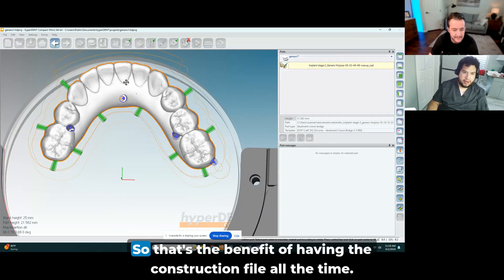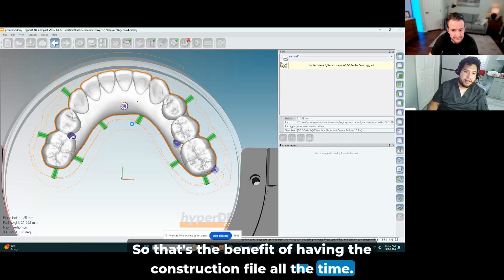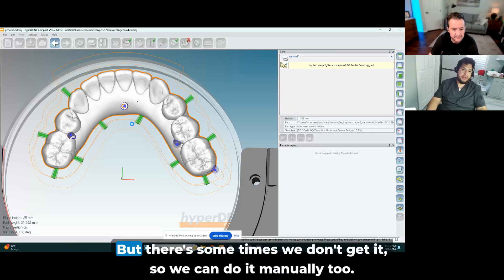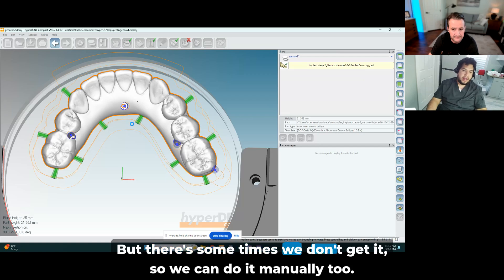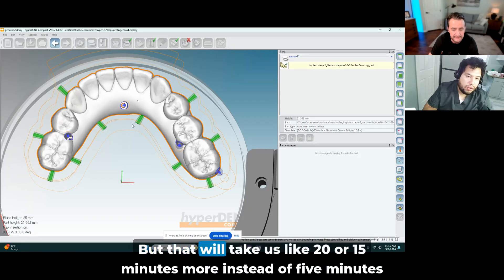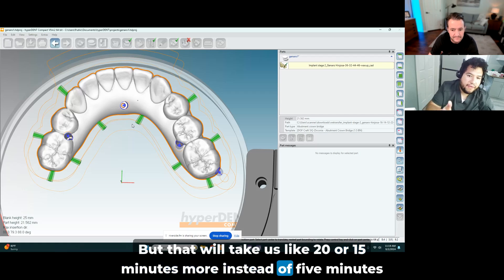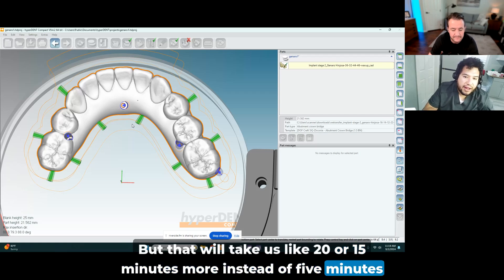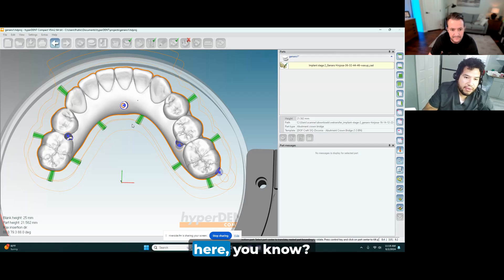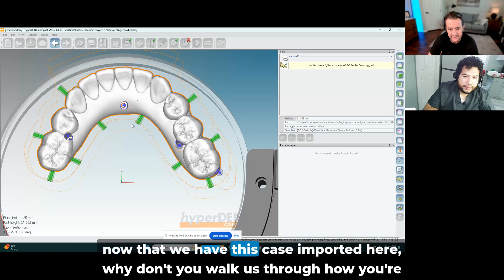And you can see the margin and the screw channel and the right position of the hybrid. Awesome. So that's the benefit of having the construction file all the time. But there are some times we don't get it, so we can do it manually too. But that will take us like 20 or 15 minutes more instead of 5 minutes here.